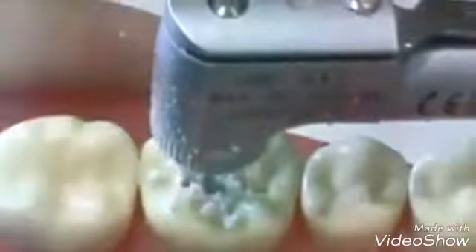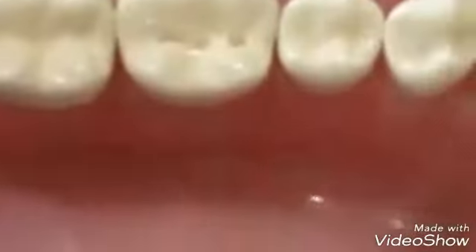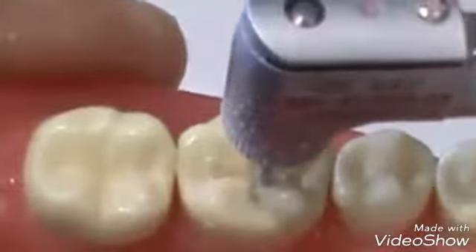No tilting is done during this phase of cutting. The bur should be upright or perpendicular to the occlusal plane.